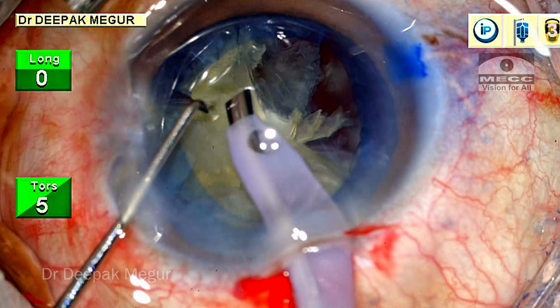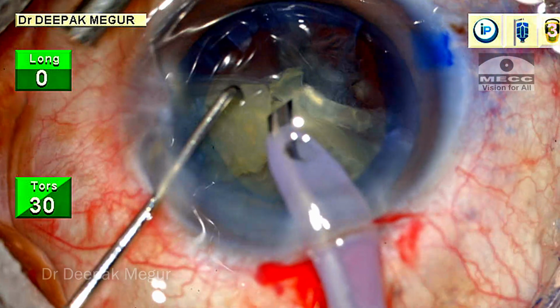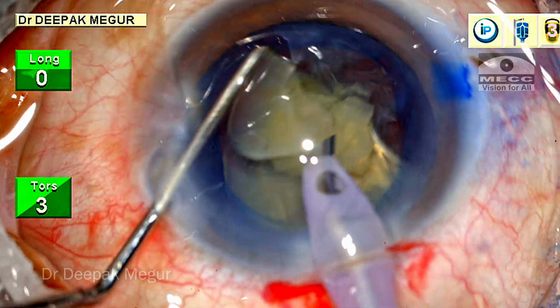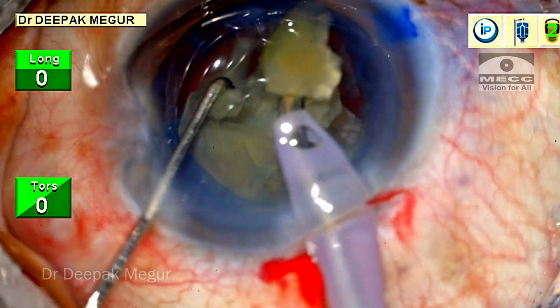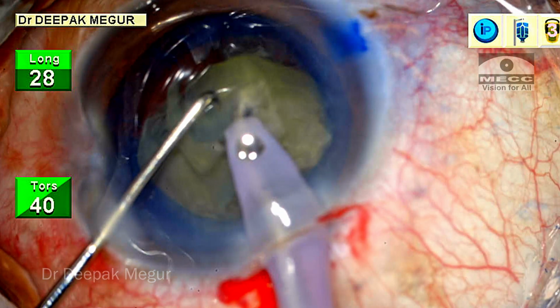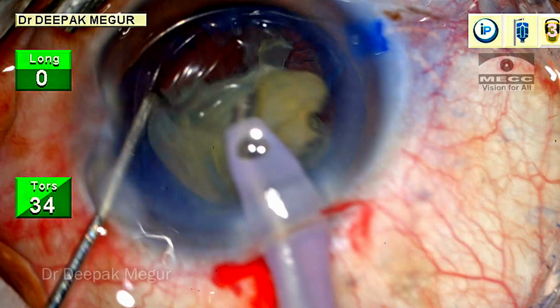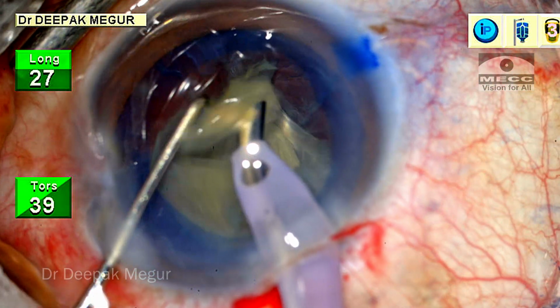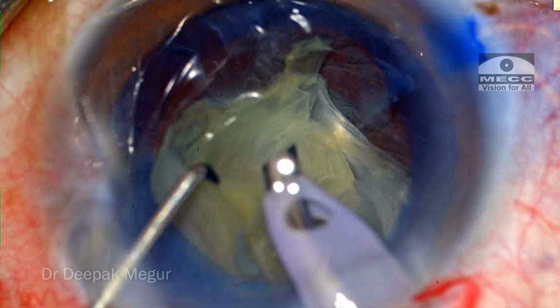So now I'm left with the last three fragments, and two of them appear to have joined at the posterior plate. Nevertheless, the fragments are flipped aside. A gentle lateral separation maneuver ensures that these fragments are freed and each of them is now being emulsified. In the background, I can see the epinucleus is there, and we have a large single last fragment remaining. I thought after just emulsifying this piece, that should be the end of the nucleus management.